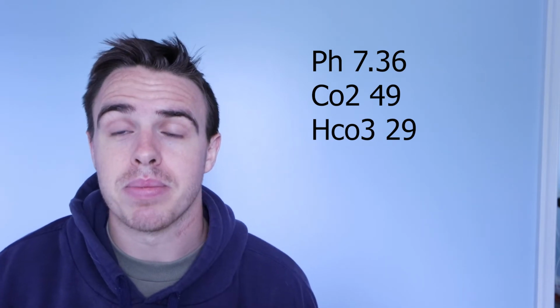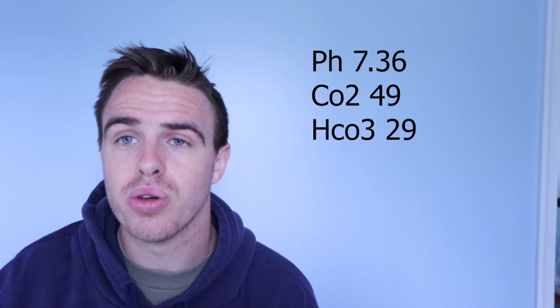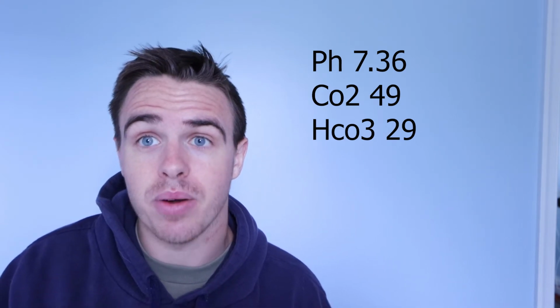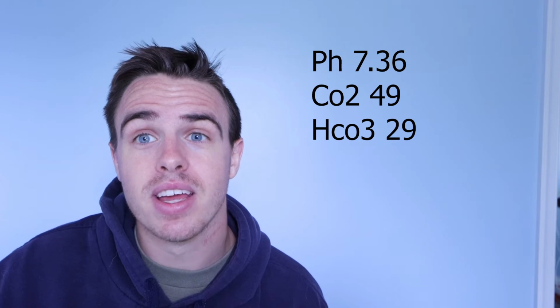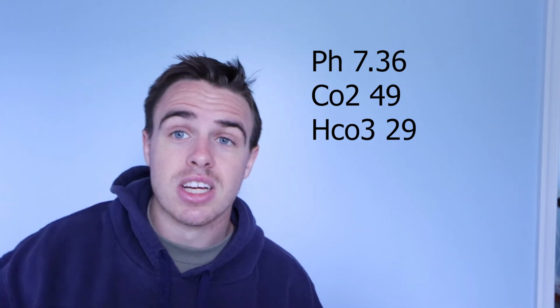When something is compensated, this means that the CO2, for example in this one, is causing the pH to go down, but then the bicarb is compensating for that. So it's at a higher value than it should be to bring the pH back up into the normal range.